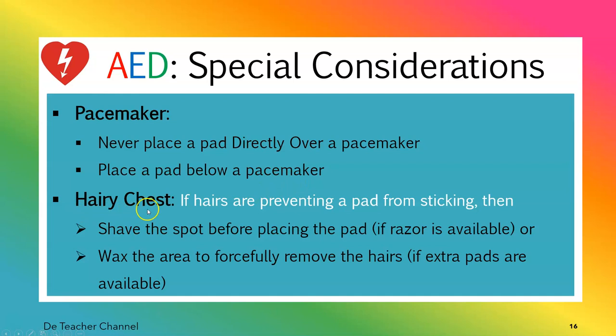What about those that have a hairy chest? If hairs are preventing a pad from sticking, remember the pad is sticky. So if the hairs are so much and the pads are not sticking, then you have 2 options. If a razor is available, you can shave the spots where you need to place the pads.